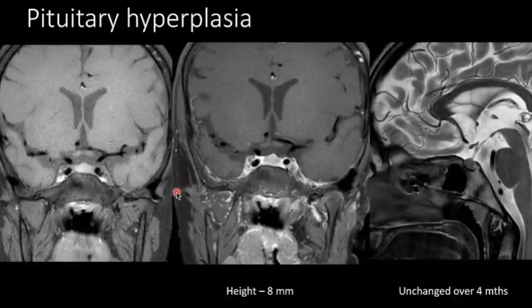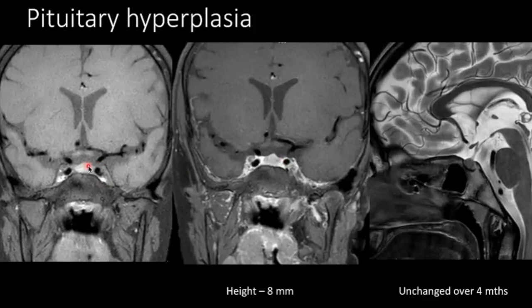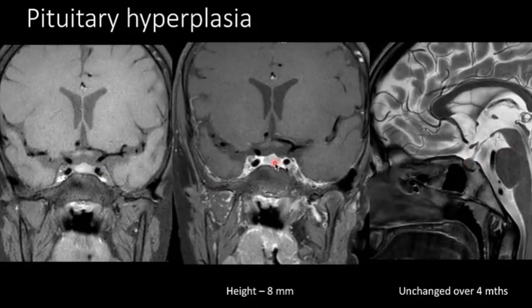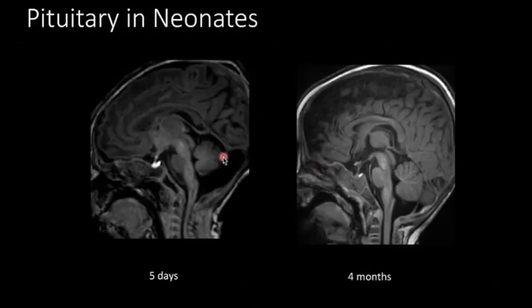Here we have a seven-year-old girl with early puberty and hypercortisolism. MRI was performed to rule out a sellar mass. We saw a superiorly convex border of the adenohypophysis and increased height — measured at 8 mm, which is above normal for age seven. On follow-up it was unchanged and suspected to be a pituitary adenoma, but this was actually pituitary hyperplasia. Another variant is hyperintensity of the adenohypophysis in neonates — seen in a five-day-old infant — which resolves over time.